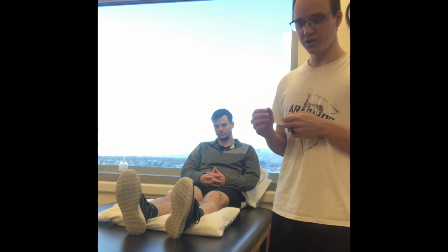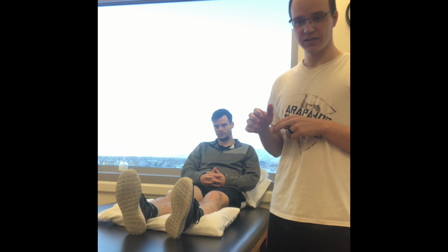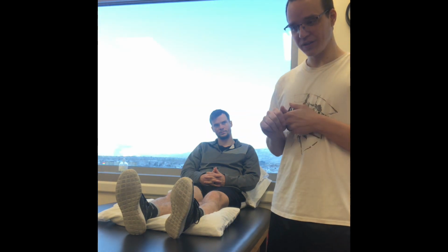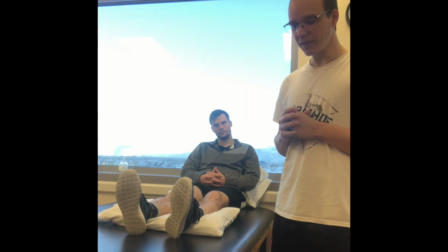But other reasons you would use electrical stimulation is to reduce or prevent edema. And specifically what we're going to do with the biphasic current today is we're going to cause muscle contraction. This will help with his atrophy. It's pretty common after an ACL reconstruction to have some trouble firing the quads, and our patient is having that with his right quads today.